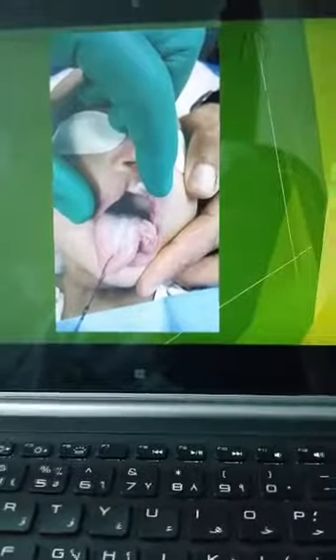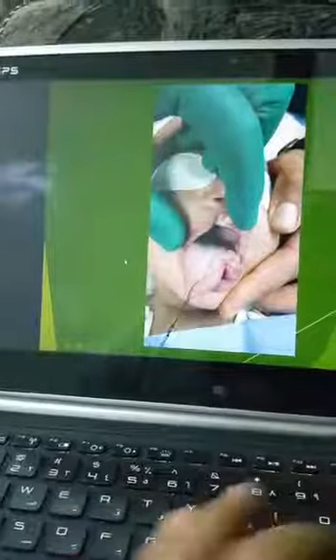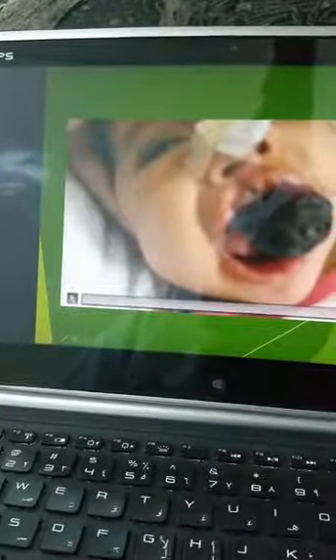And here, this is a child, 60 days, female, with the cleft, and let me see, I think this is a video with the bleeding. Because it is a child, we did this under GA and interstitial technique, and then we remove this part after. This is the interstitial technique where we go from normal tissue to avoid bleeding. I should not perforate the hemangioma. This is the treating. I should not perforate. I just apply the laser away and use just my power to treat this case safely.